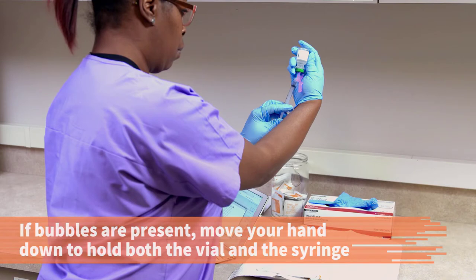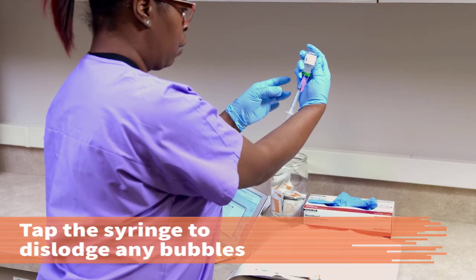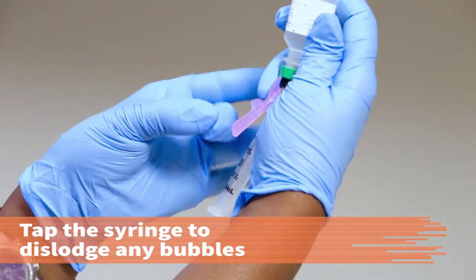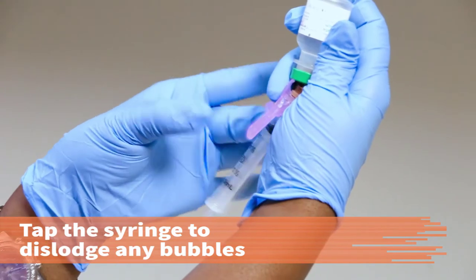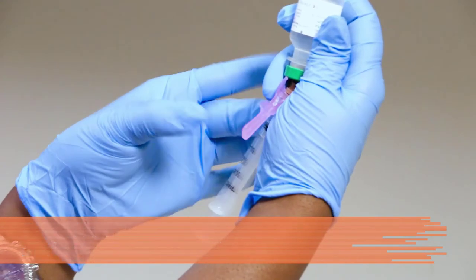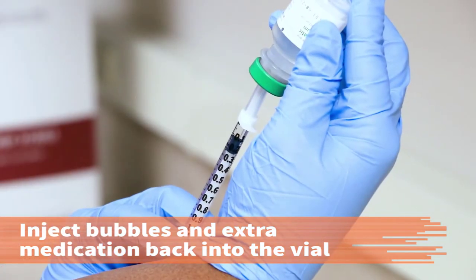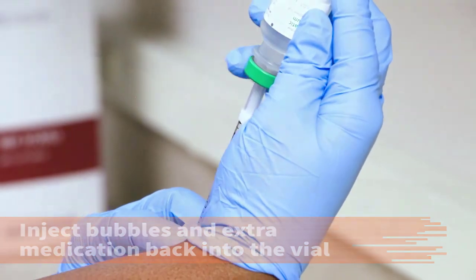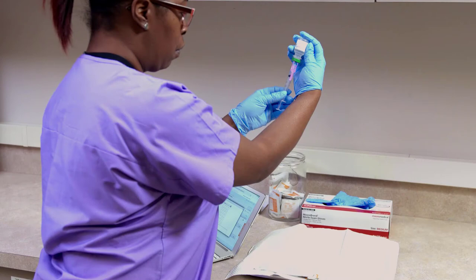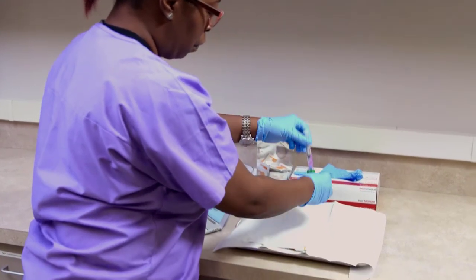With your dominant hand now free, use it to tap the syringe until the air bubbles dislodge and float into the tip of the syringe. Inject the air bubbles back into the vial with the extra medication that was withdrawn. At eye level, make sure the accurate amount of medication is in the syringe unit.